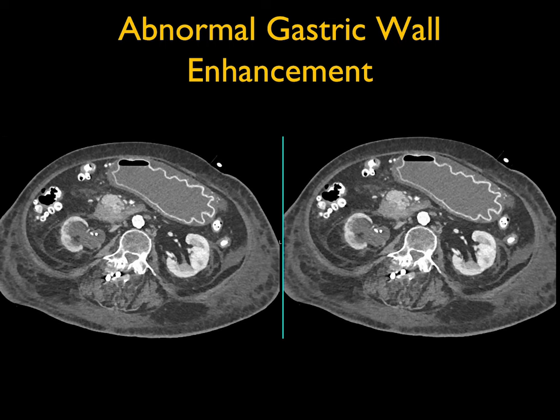Case number two — what are we looking at? Really prominent gastric wall enhancement. It looks like you drew this with a pencil or a pen. It's really thin and markedly enhancing. That means hyperemia. Typically when you see this, we're thinking about gastritis.